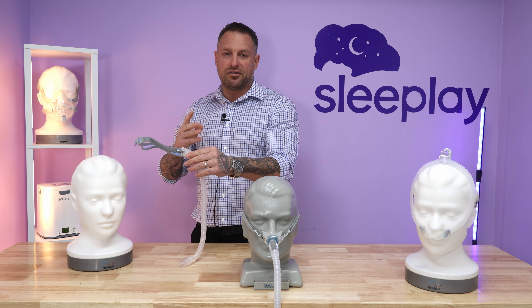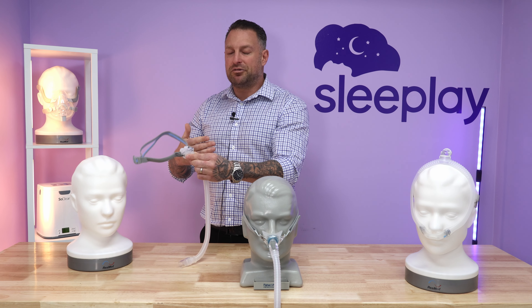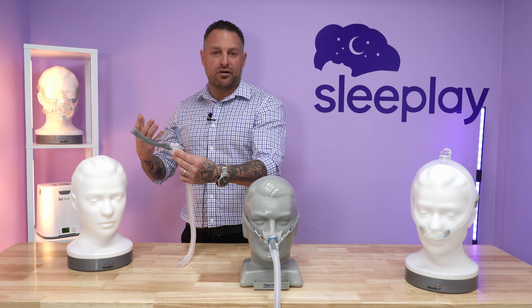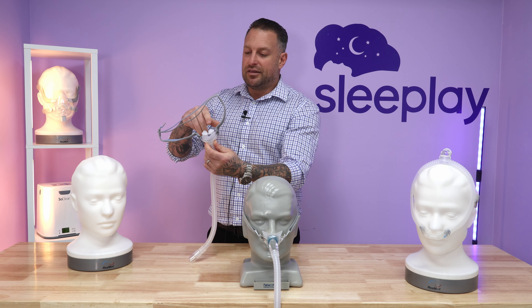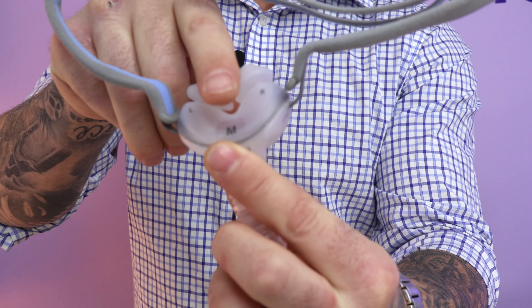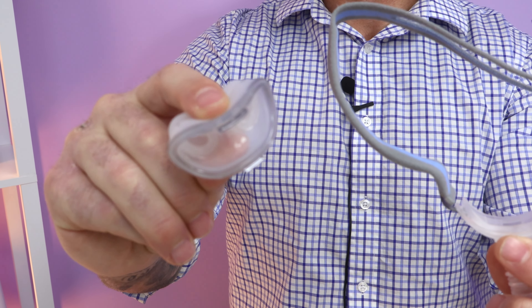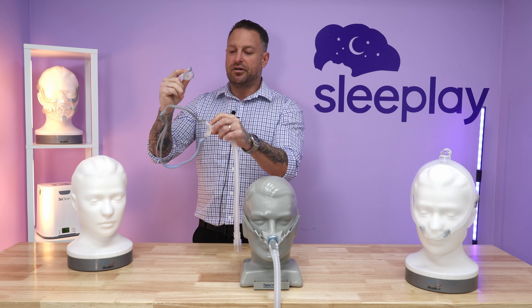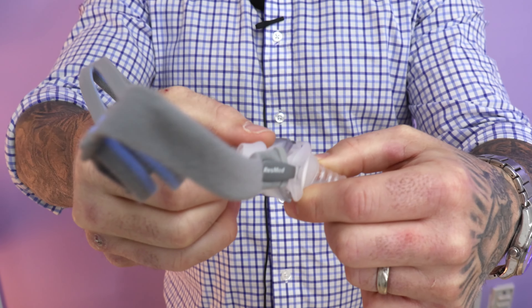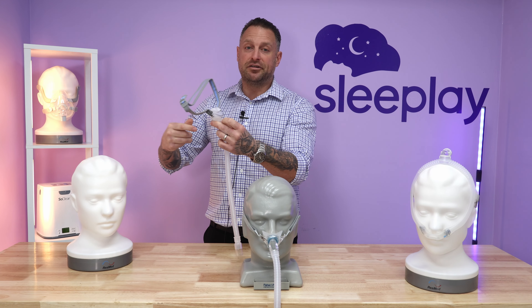It's a little hard to get used to because of the air going directly into your nose, but if you allow yourself time, you can get used to this and you'll be happy you did without all the extra hardware on the face. The cushions, the little pillows, are here, and the size is in the back. You just grab in between and pull that off — that's how the pillow comes off. There's a little tab here and a tab here, one larger than the other, and it matches the holes. You just pop it back on when you go to switch the cushion.